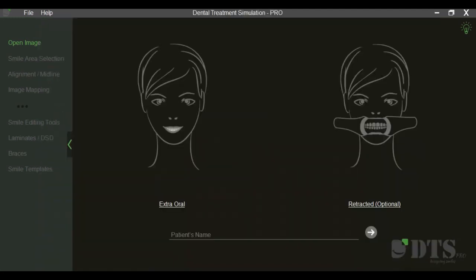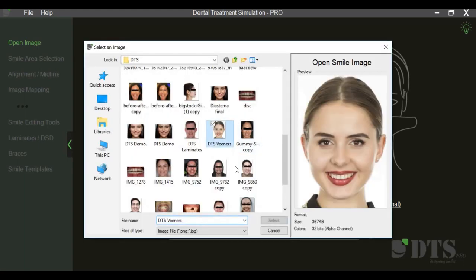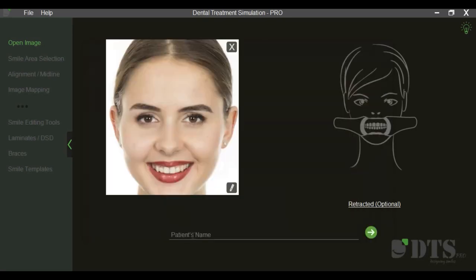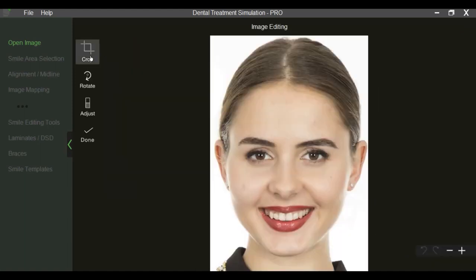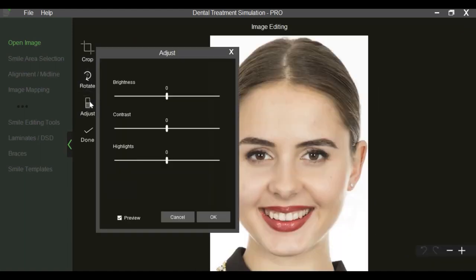The opening screen has options of uploading an extra-oral image as well as the intra-oral retracted view. For most clinical situations, a single extra-oral image is sufficient to carry out the desired simulations. The uploaded image can be cropped, rotated, or adjusted as required.